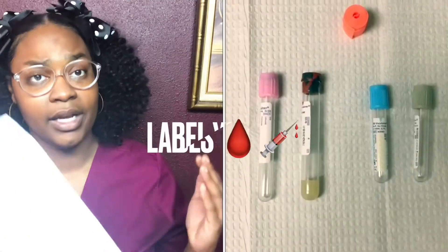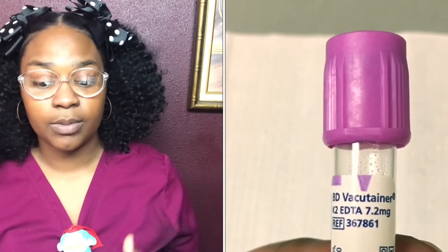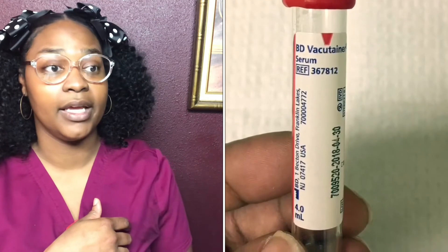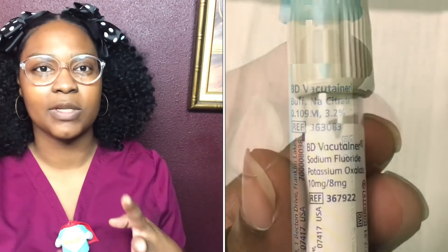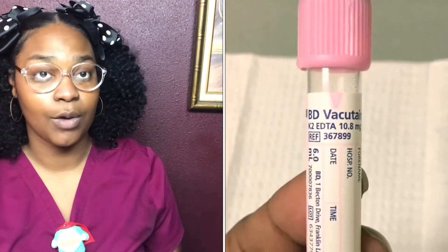Remove the needle immediately and put the cap back on right away — that's another important step. Then label your tubes. I prefer to have everything labeled beforehand. When I was working as a medical assistant for OB-GYN during my externship, we would label the tubes before drawing because you don't want to mix up someone's blood work. Put the labels on before, verify the patient, and then complete everything.